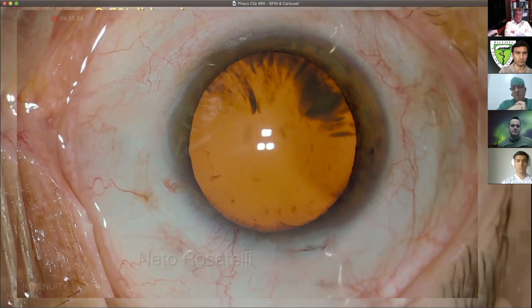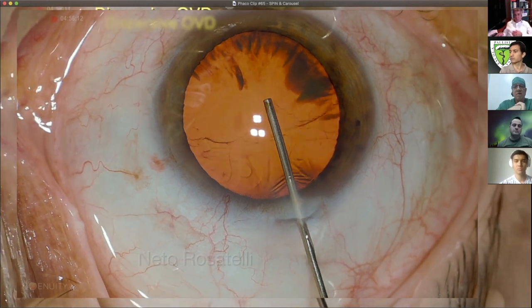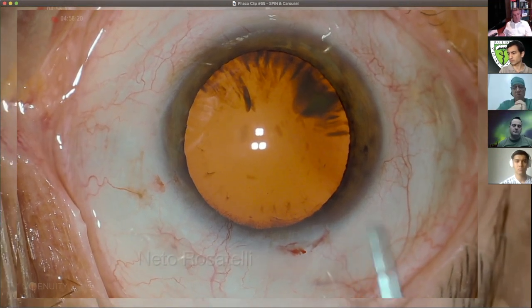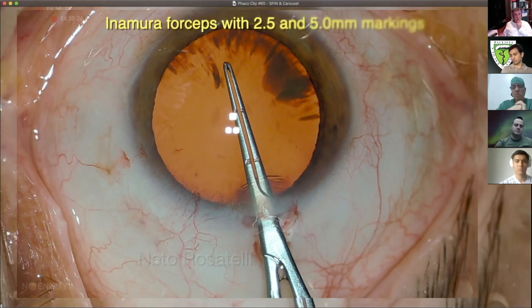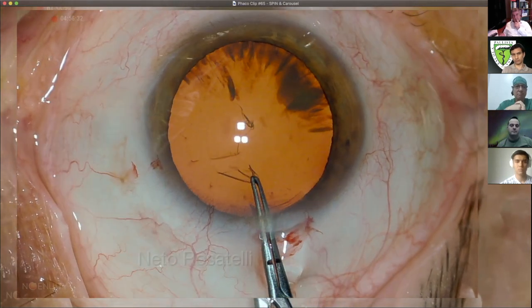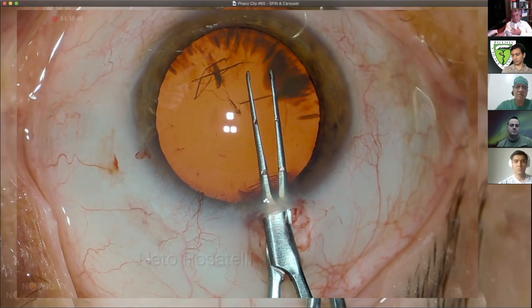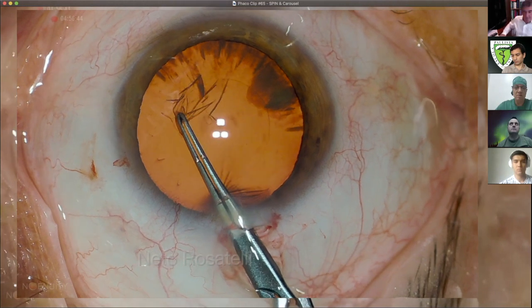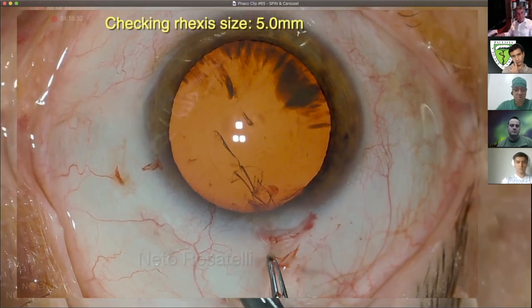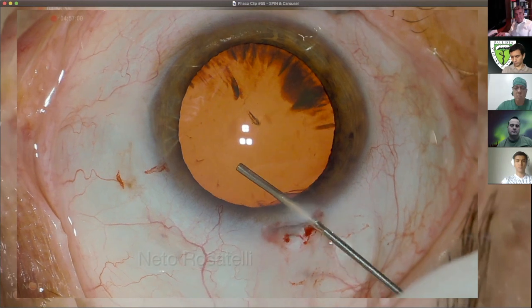It's not every time that we are able to achieve a very beautiful rotation and emulsification of the nucleus, as you will see in this one. But even when the rotation of the nucleus fails, it works very well, and it's a less invasive technique. So there is almost no movement of the phaco tip, and things happen only by the fluidics of the intraocular flow when we emulsify.